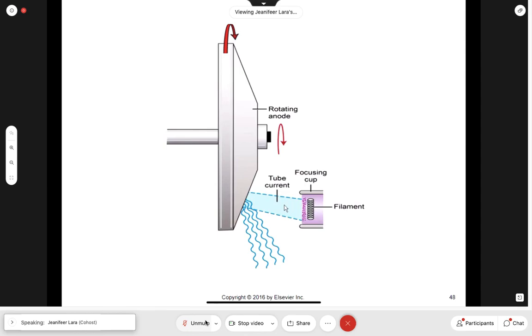I hope that, for right now, that's what you need to know. What energizes the anode? Voltage is what we're going to learn in the next chapter. But that's taking us a little bit further. This chapter starts to bring in a lot from the previous chapters, the words, and I'm trying to take a lot of them out because I'm not there yet. I don't want you to get caught up in the previous chapter words. If I'm not introducing them, don't worry about them just yet.